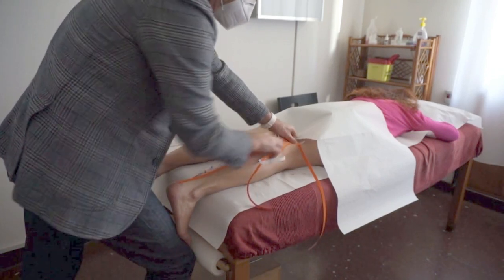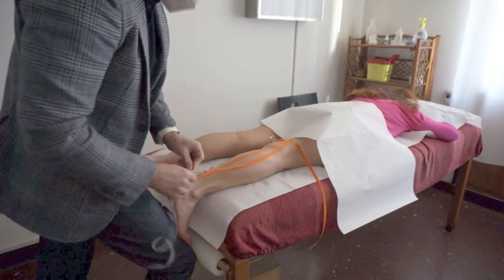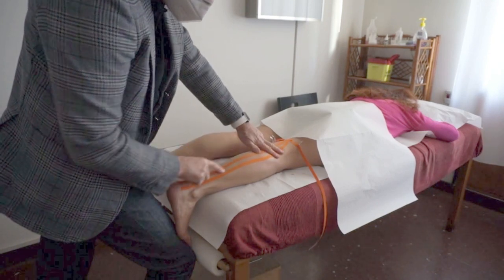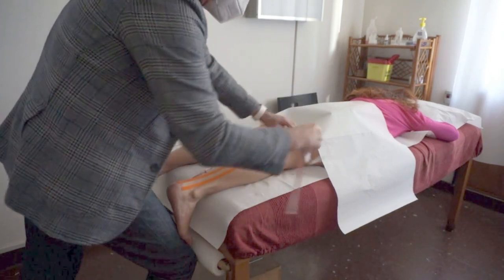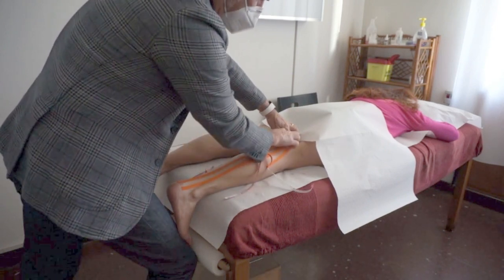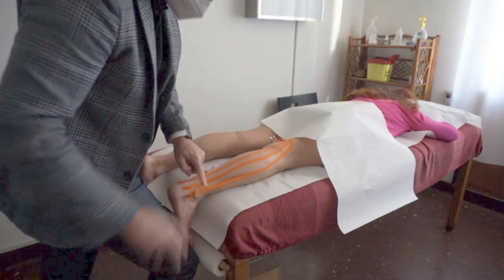Tape cut between 3, 4, or 5 mm will have an even more superficial effect on the sensorial and tactile action, meaning it acts over the neurological pathways and nerve endings.